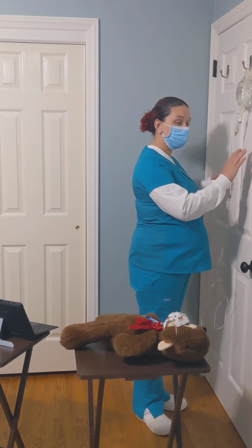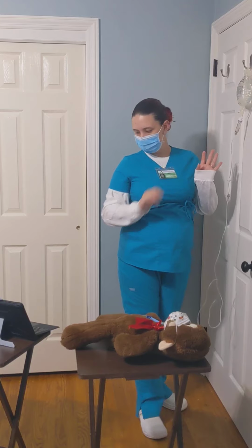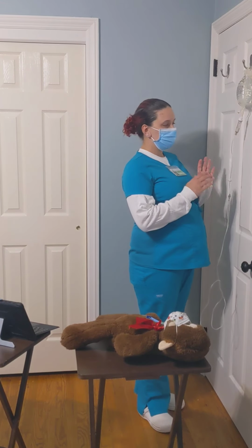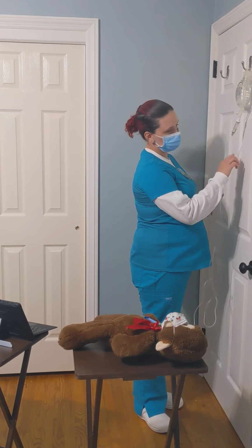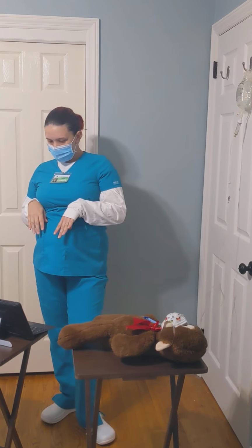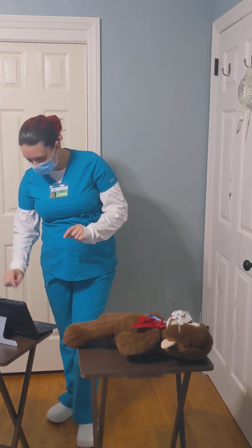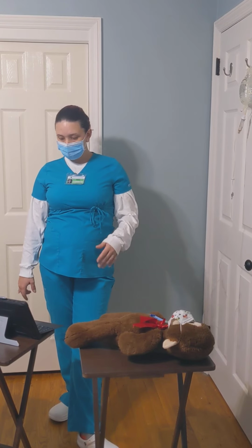So I'm going to program the pump with the medication. We have our Zosyn, 3.375 grams. It's in 100 mLs and it needs to infuse over 4 hours. So we're going to program the pump for 25 mLs per hour. And I'm going to document in the MAR that we have hung it. We already scanned it. I'm also going to document this in her chart.